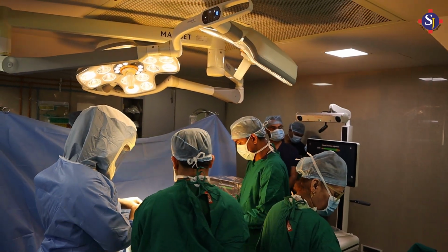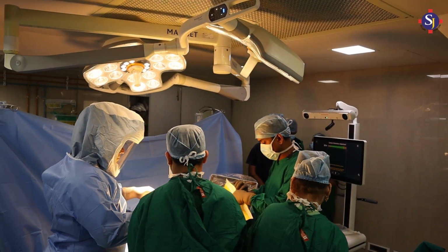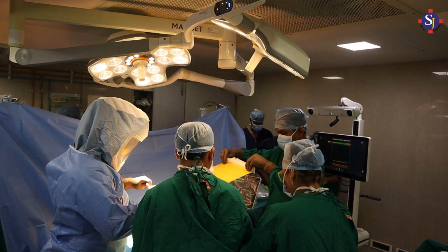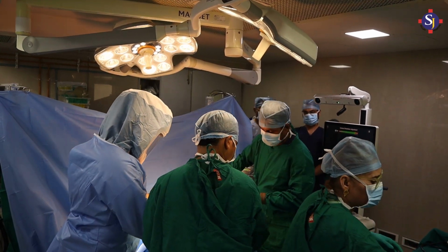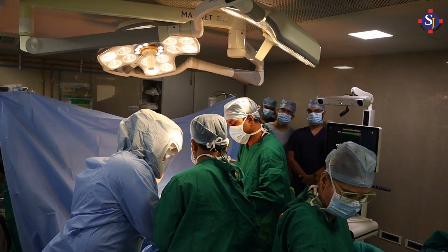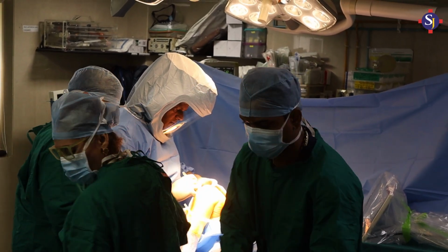Conventionally, knee replacement surgery has been an open surgery with jigs and instruments which go into the canal. This has some issues like imprecise cuts, and stiffness and pain post-op. Vis-a-vis, what we are doing is a robotic knee replacement surgery in which the cuts are super precise and there is no need to enter the medullary canal.